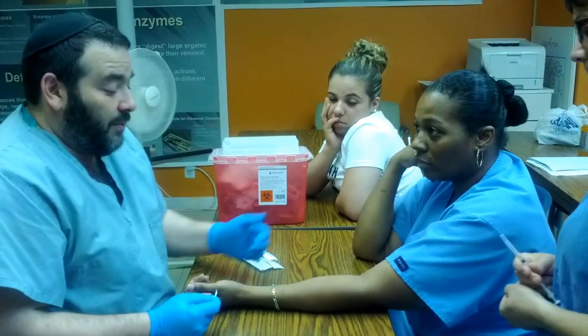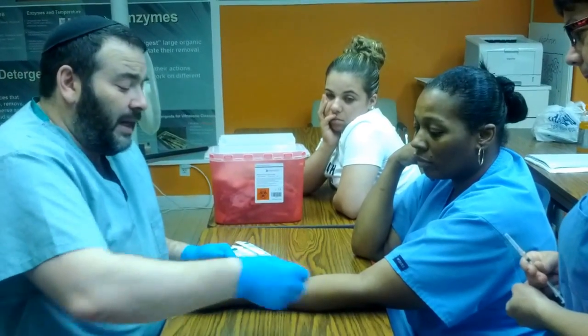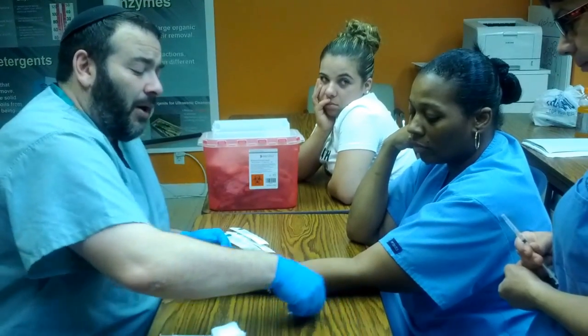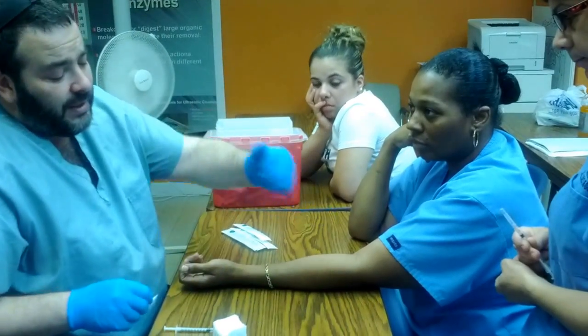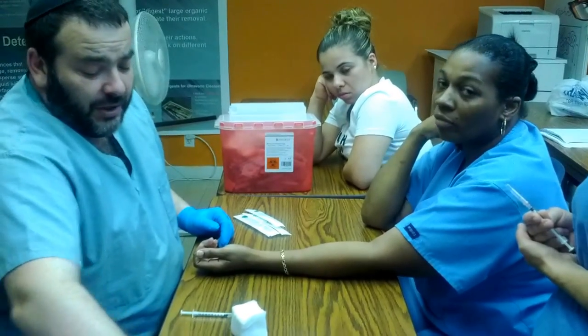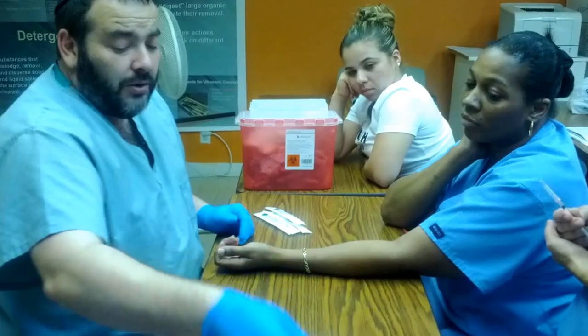As you just saw, I wiped the area clean, and I did it from the middle out. We never do it in a circle — always in a spiral, going in increasing circles from the middle out, pushing the dirt out to the outskirts. For any injection, make sure the alcohol dries.